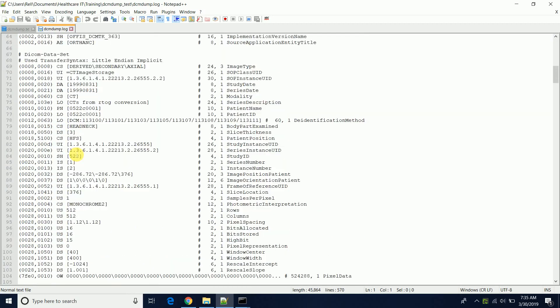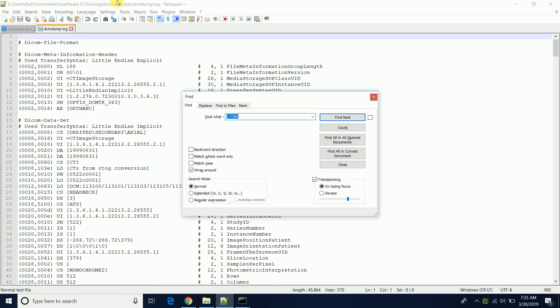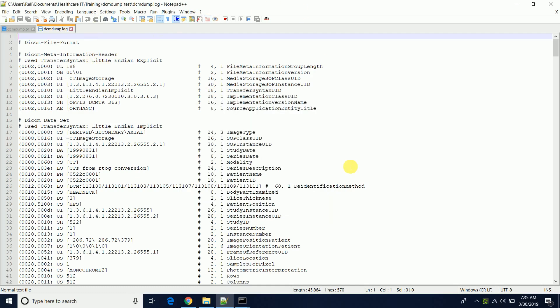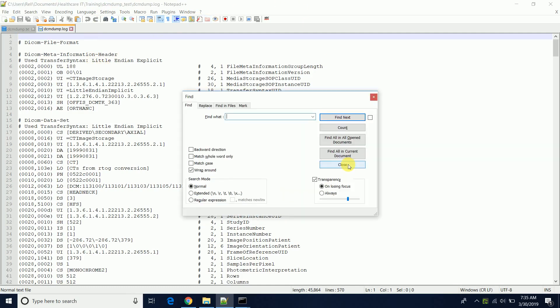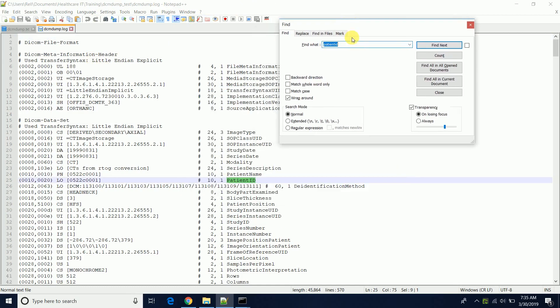And so if you were looking for something in particular, you could just do a search. You can just do control F, search for patient ID, and then you can just find certain tags and see what the actual value is, the actual DICOM tag itself. You could just do a search and find the information that you need to see.